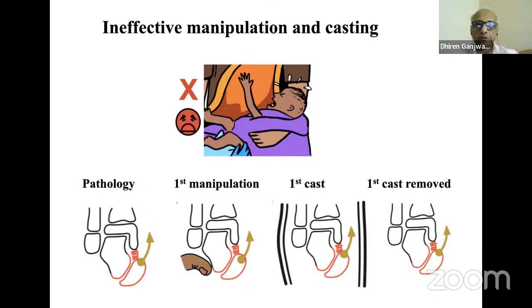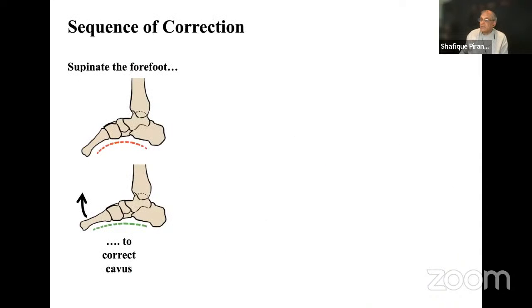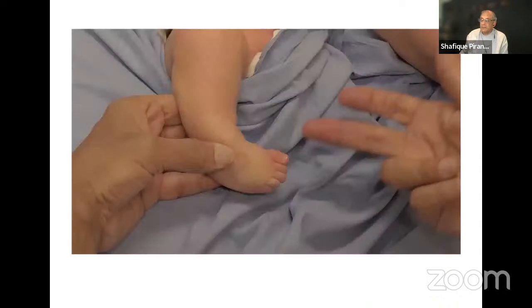Yeah, so that is one option, if breastfeeding is not acceptable to parents or to the family or to the doctor. So that is one option. Exactly. Yeah. Then there is a question. In a unilateral clubfoot case, still we need to put a foot abduction brace in 70 degree. Okay, yes. So let's go back to this slide here.